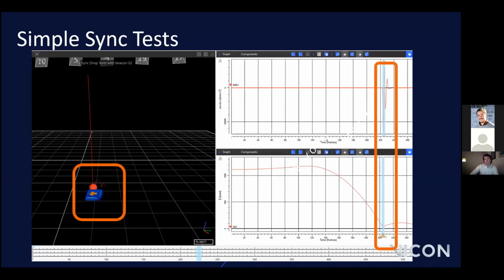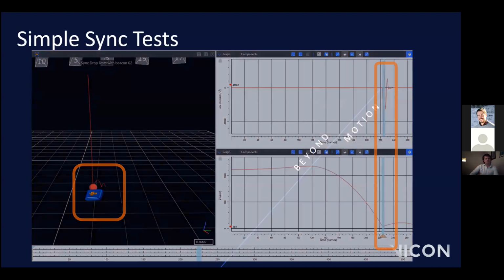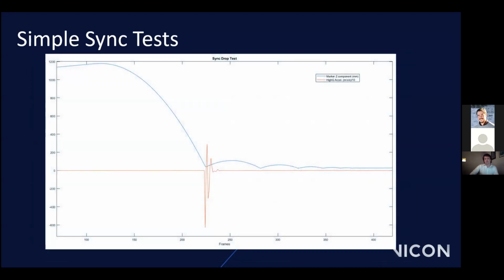When the marker first comes into contact with the sensor, we should see the initial reaction from the accelerometer. When comparing the outputs together, we can see that the IMU and marker data are perfectly aligned. And that is the minimum point of the Z component of the marker, where you'd expect the first initial reaction from the sensor to occur.